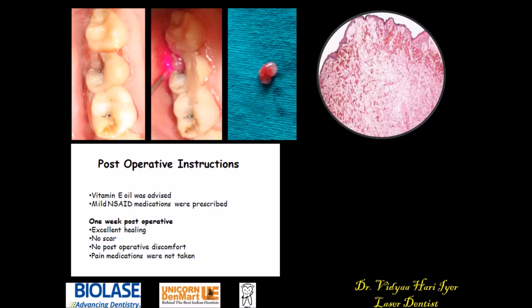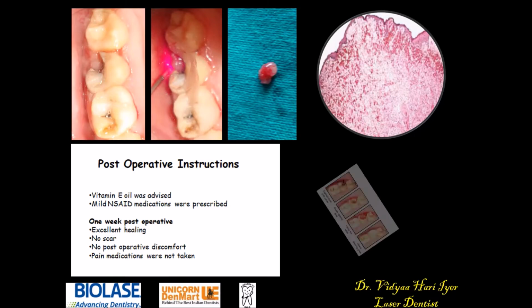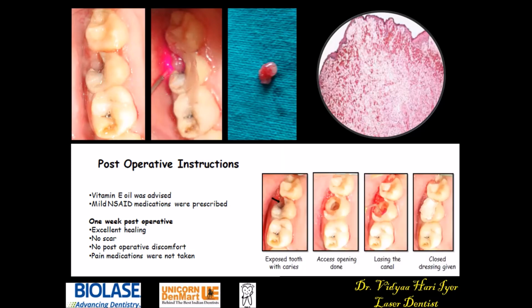You can also ask them to have some ice cream or anything which is going to be cold so that it will help them. And this is very important, my dear friends, because then the rest of the procedure can be really followed with a single sitting. So here the patient had come for a root canal therapy, and we just had to remove that tissue, and then we could see the area better, and then we went ahead with a root canal of that particular tooth.